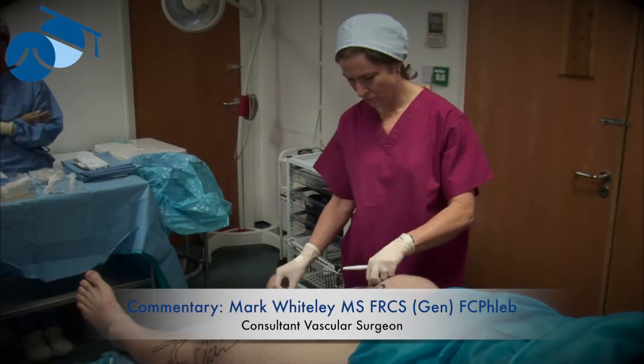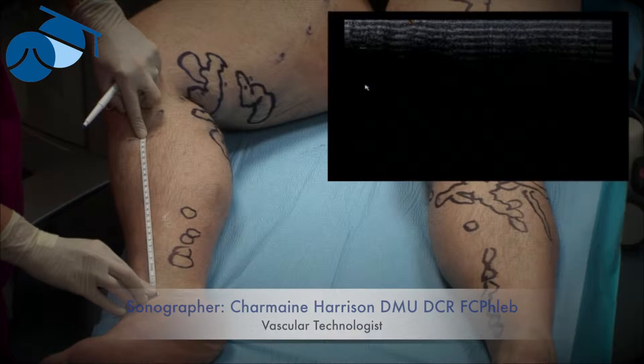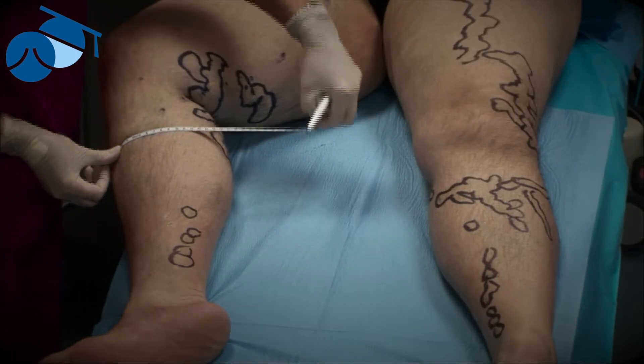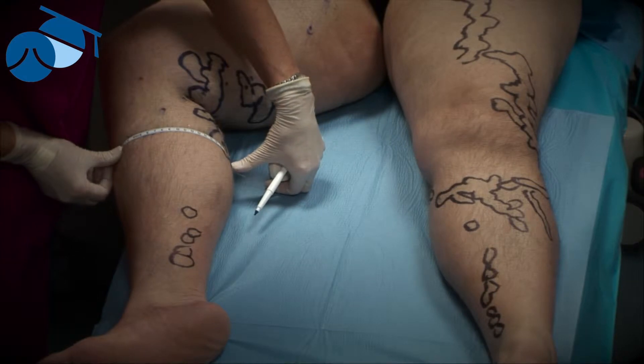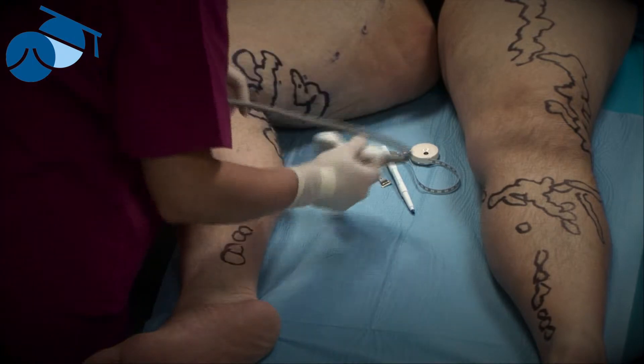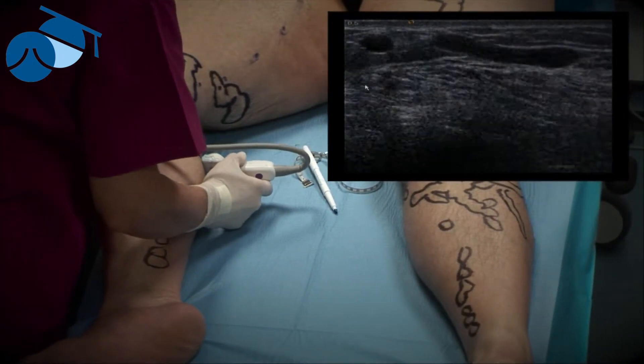Here we're going to mark an incompetent perforator on the diagnostic scan. We found it was 27 centimeters above the medial malleolus and 20 centimeters back from the tibial border. When the patient is lying down, the perforator is remarkably in the same position — usually it can move a centimeter or two, but that's all.